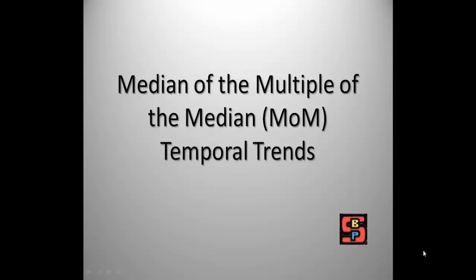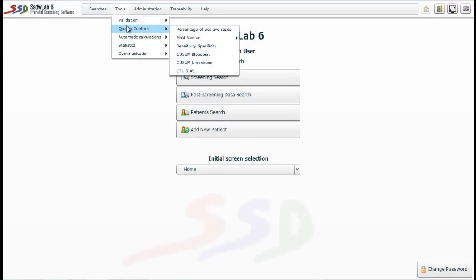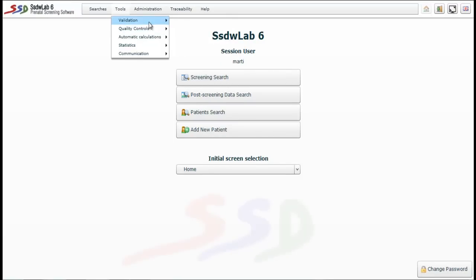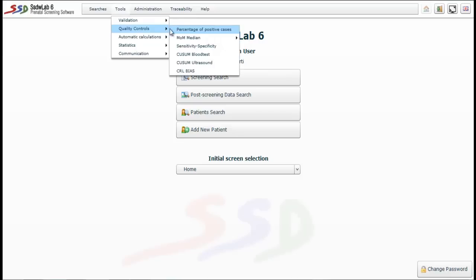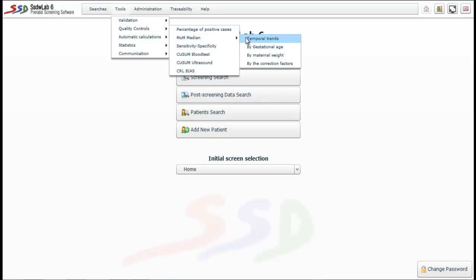Now let's see how to assess the median of multiples of the median and their temporal trends. We return to the initial screen, select the Tools menu, then Quality Control, and choose Median MoM and Temporal Trends.